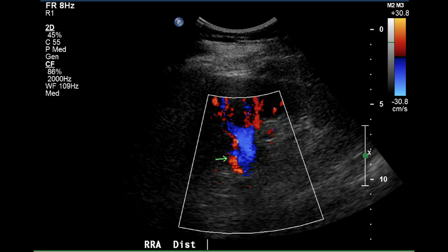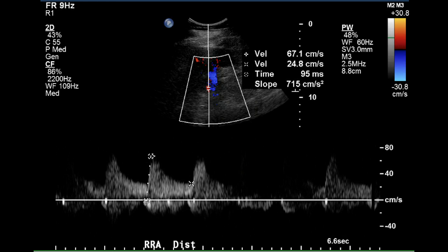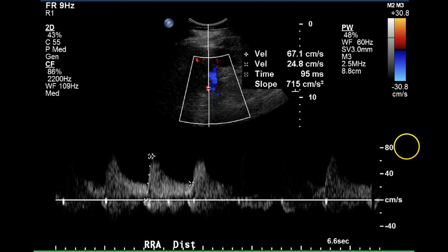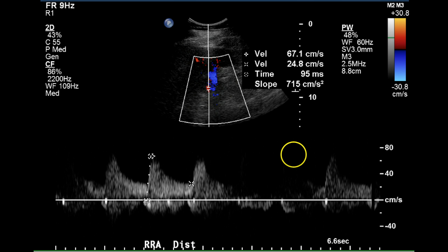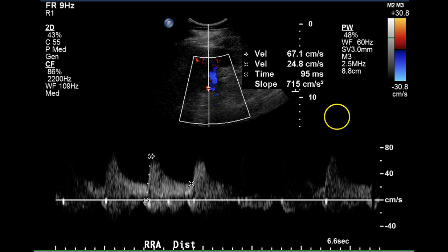This is an image of the right renal artery distally, where it enters the right kidney. The velocity at this point is 67 centimeters per second with a very sharp upstroke under 100 milliseconds, steep upstroke slope, and this is a normal waveform for this vessel.